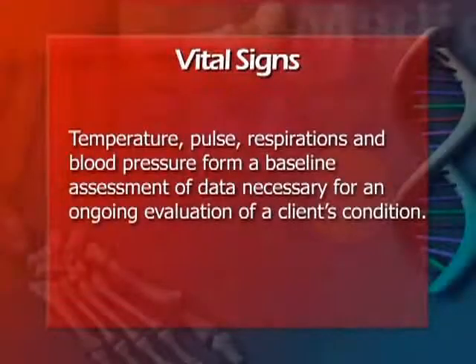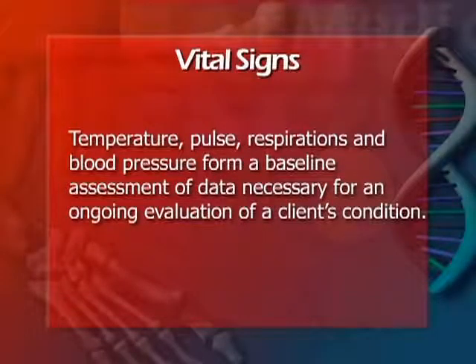Temperature, pulse, respirations, and blood pressure form a baseline assessment necessary for evaluating a client's condition.